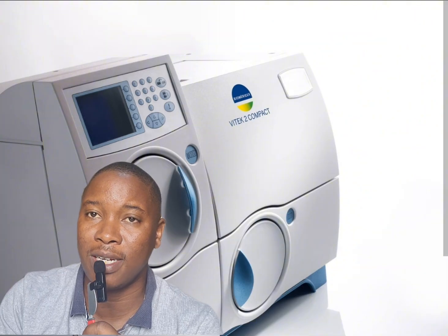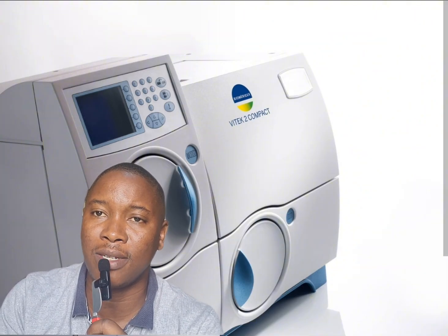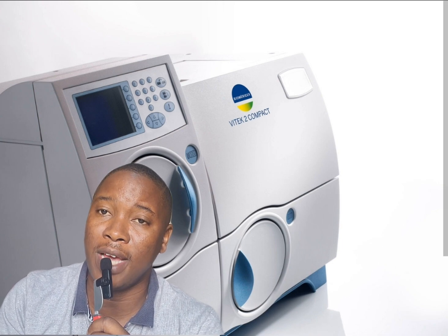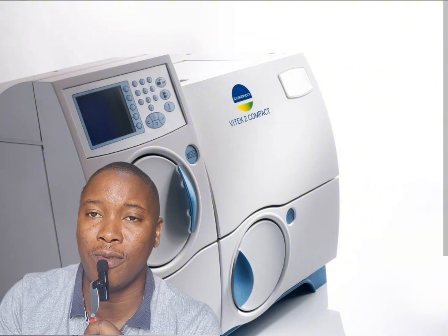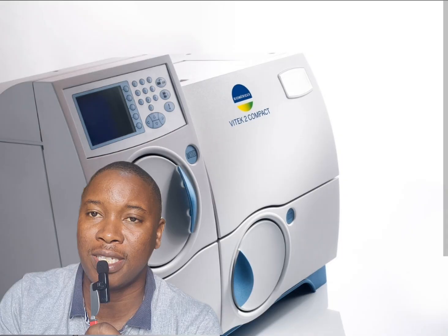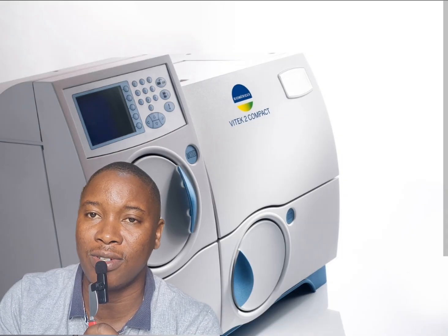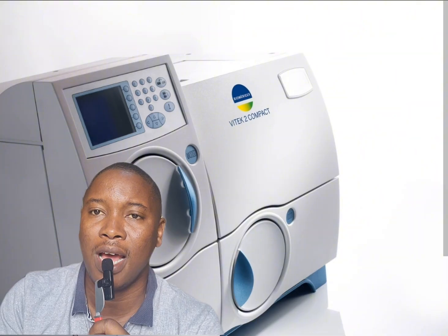The Vitek 2 machine is important because it's able to give you the identity of gram-positive bacteria, also the identity of gram-negative bacteria. It's even able to give you the identity of some fungi and some yeast, making it a very valuable machine for use in the laboratory. It's useful for research, it's useful for clinical diagnosis, it's useful for field work, it's useful for a lot of things, and we get to use it.